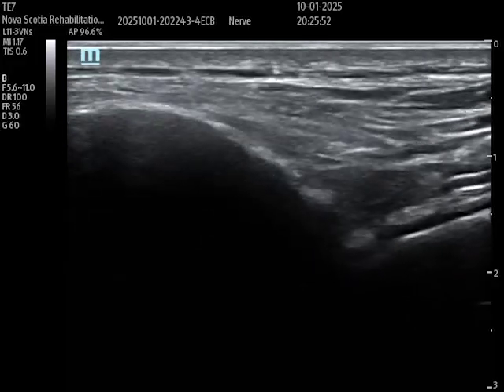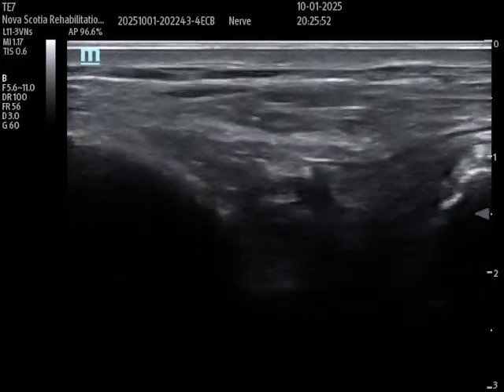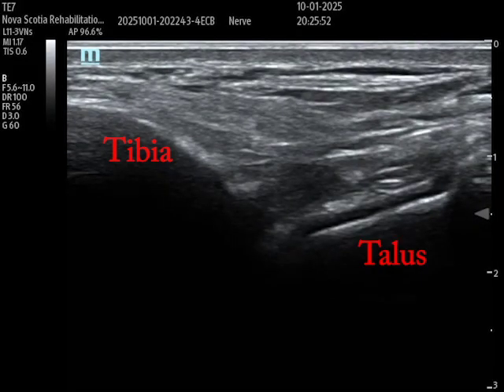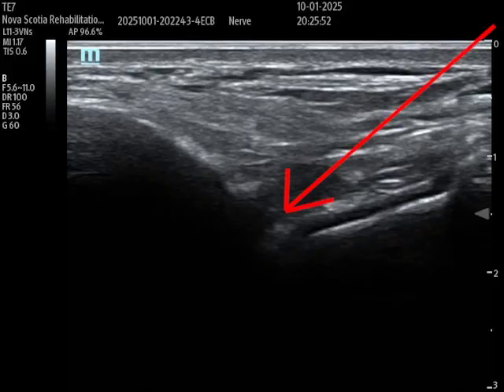I'm going to translate the probe medially until that tendon disappears. I'm dorsiflexing and plantar flexing, and you can appreciate the joint. You have the tibia on the left, the talus on the right, and you can see that anechoic black hyaline cartilage above the talus. This is an area where I could do a long axis in-plane injection — avoiding the artery, avoiding the tendons — and place it in that space.